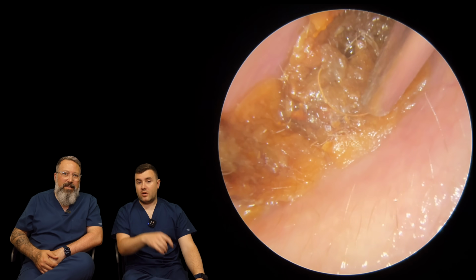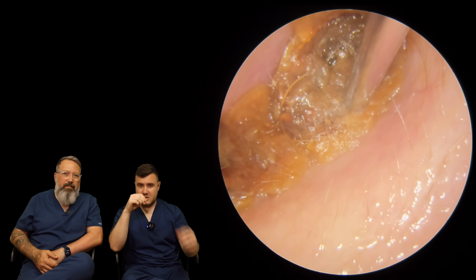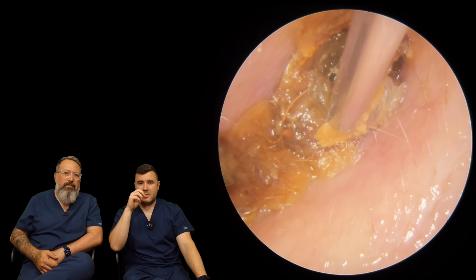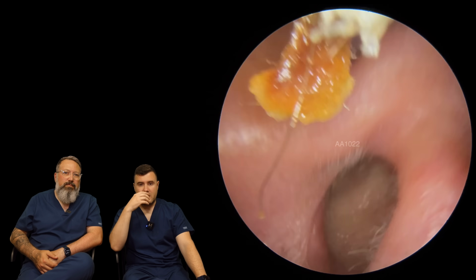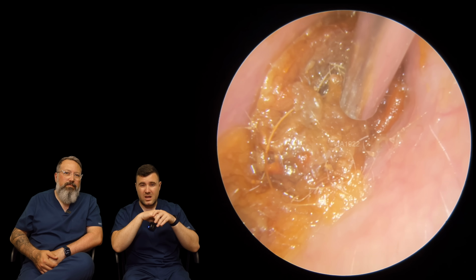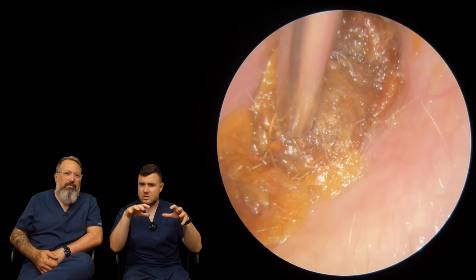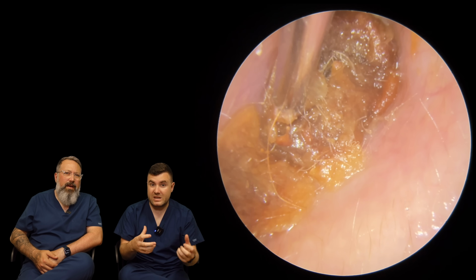The reason I've used the fine end is purely because the patient has mentioned a little bit of tinnitus, a little bit of ringing. It's manageable. It's not loud. It could possibly be just to do with the blockage, but I didn't want to risk making it any worse, to be fair. So I wanted to keep it down as much as possible. With this being so deep, I didn't want to go straight in with the manual tools either, because I wanted to see how loose this might be. I know it looked quite compact, but sometimes they do come free quite easily.